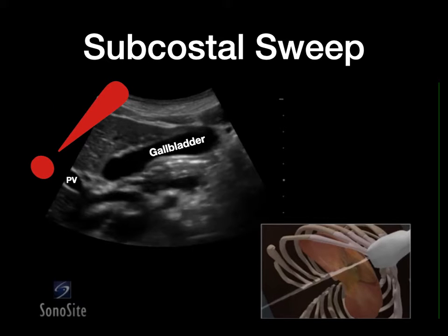The line of the exclamation point is the gallbladder, while the dot of the exclamation point is the portal vein. Note again that the portal vein has echogenic walls. Often we see the gallbladder and portal vein are connected by a hyperechoic line, the main hepatic fissure, which is an important landmark when the location of the gallbladder is in doubt.